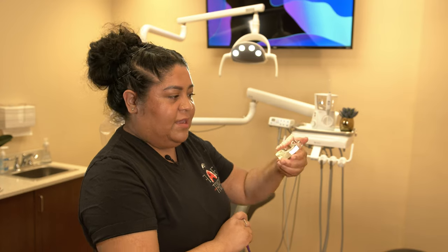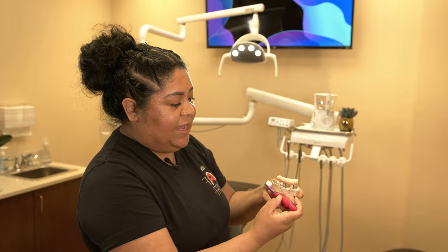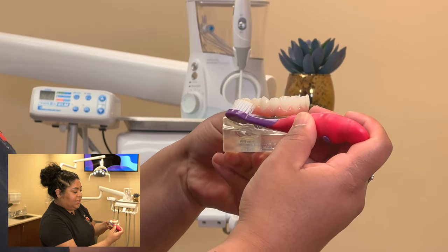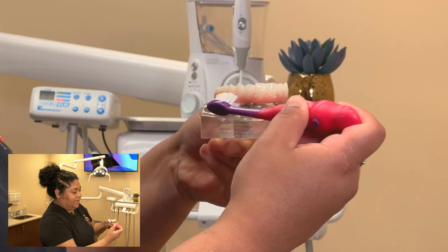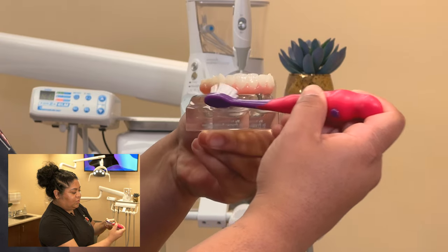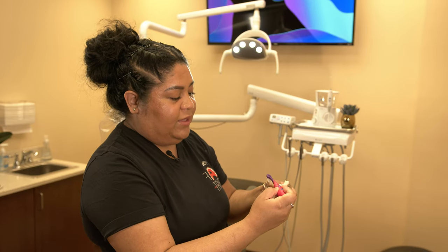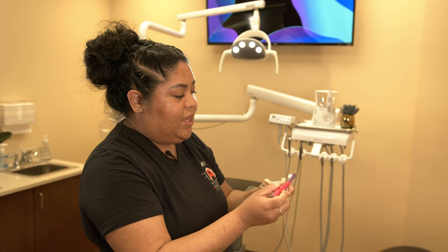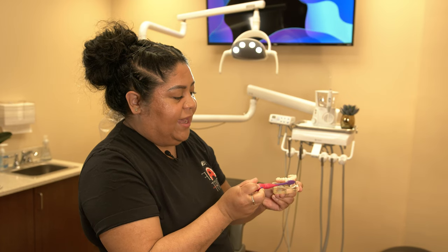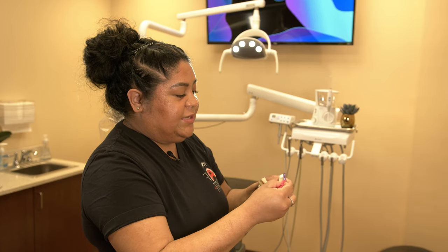This is for the top. If you're working on the bottom, it's the same exact thing — start on one side, bring those bristles underneath the bridge, and again do the same circular motion. Once you're done cleaning that junction, come back and clean the rest of the prosthesis: the chewing surfaces, the outside, and the inside. Once done with that, your brushing is completely finished.